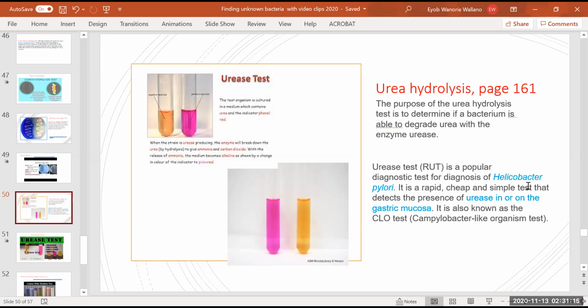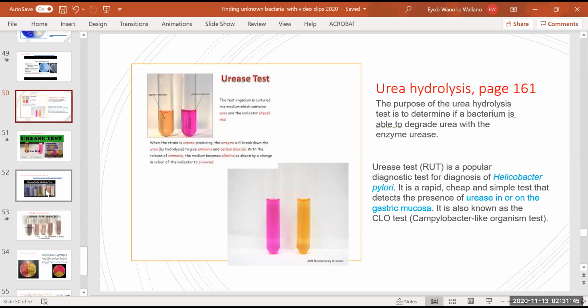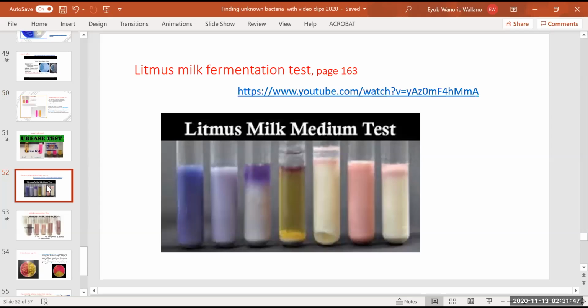You see, this is mostly a water contaminant bacteria. Some kind of water you drink, some kind of food, like fresh fruits, which are contaminated with bacteria, and then you can be infected. We call it Helicobacter because its shape looks like a helicopter. It doesn't have a uniform shape, but we call it Helicobacter. Now it is going to change the media into a cherry or purplish color. You see, it's a very interesting bacteria, really. I am not going to use that video.